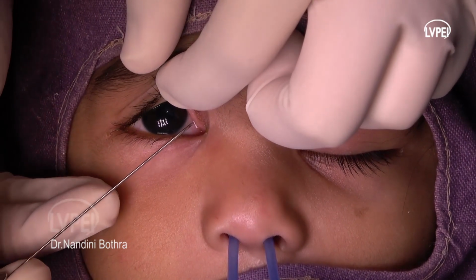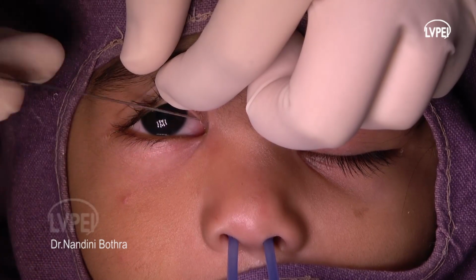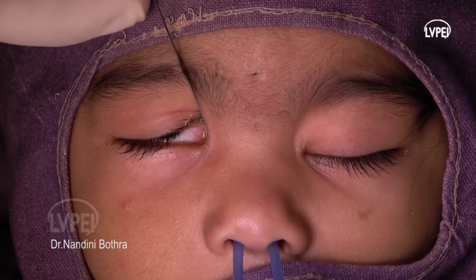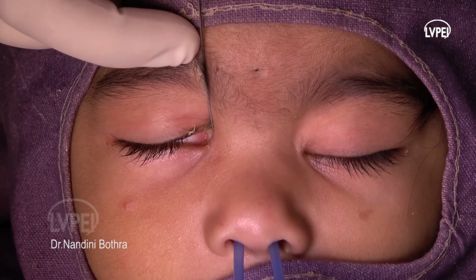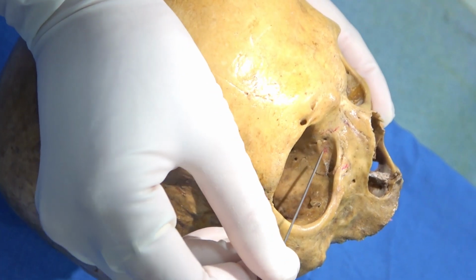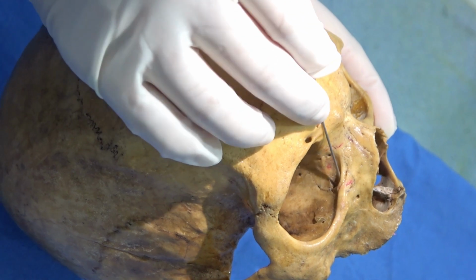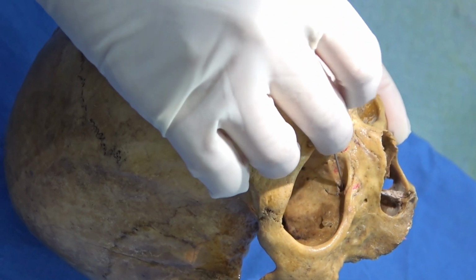First, it is inserted perpendicular to the punctum, then turned horizontal such that it is parallel to the lid margin and advanced till a hard stop is felt. The probe is then turned perpendicular and advanced in a downward, lateral and posterior direction. The probe is brought to a halt the moment any obstruction is felt.